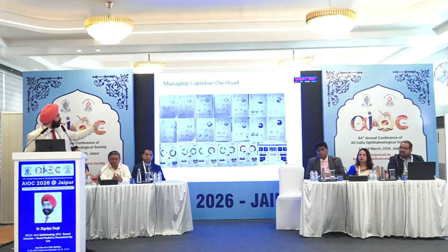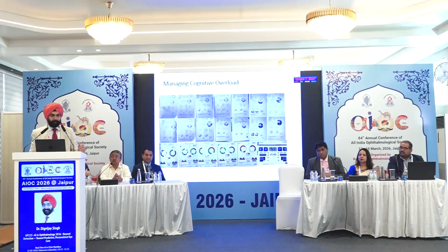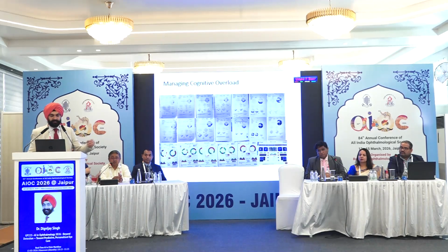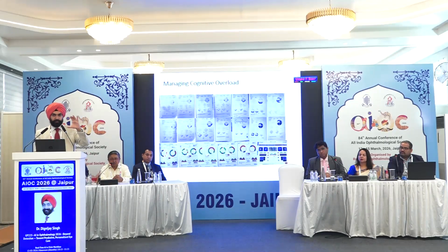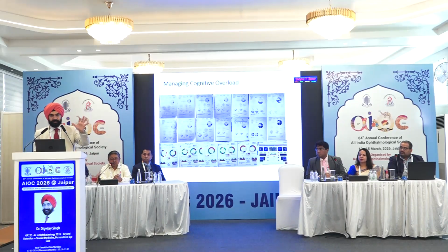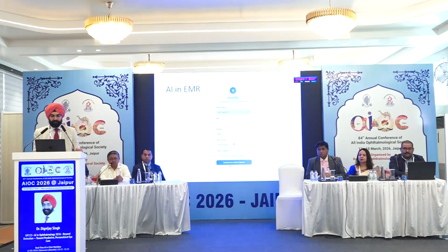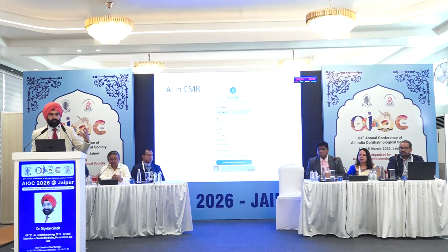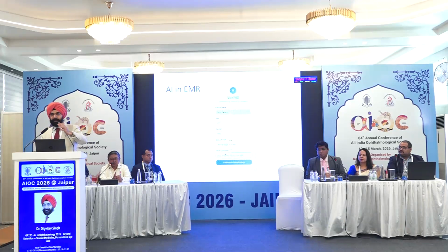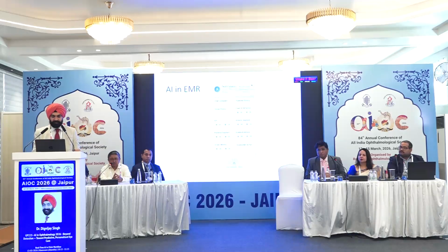A patient walks in with these many reports, says, Doctor Sahab, ye to dekho, ye main itni baar dikha diya, ab karna kya hai? And in these situations, the AI does a very good job of quickly summarizing this for you. You can take a single photo or separate photos, they should be clear of course, and upload it, and it gives you a very good output. So the staff can do that for you, and it will give you an output saying that this is the progression over time, it has become worse in the last 3 months, so please take action on this patient.